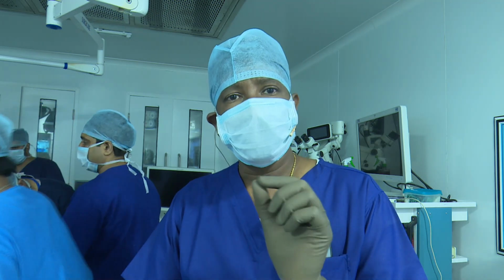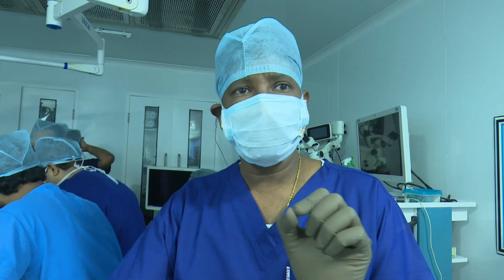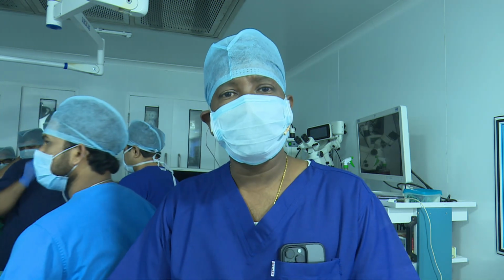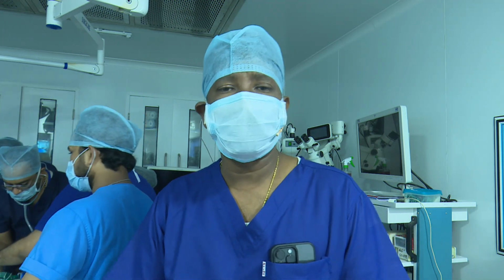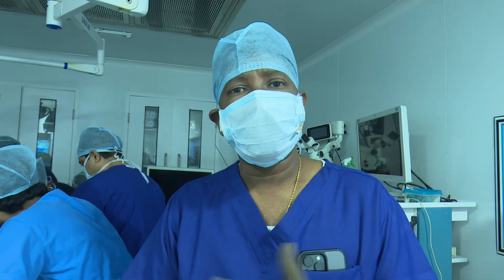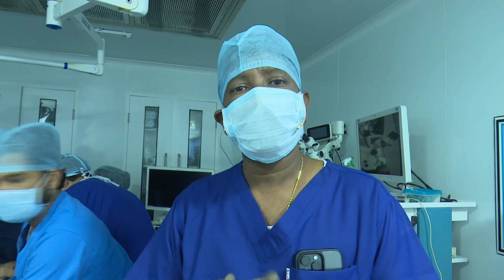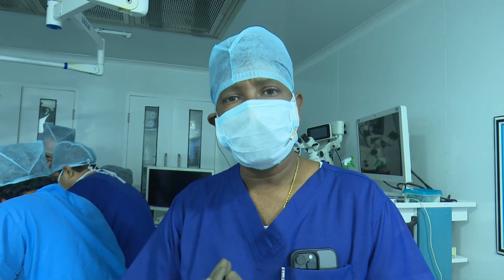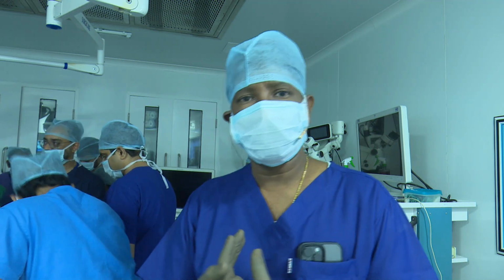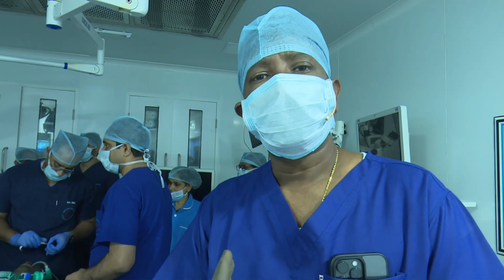So we keep the endoscope just at the tip of the uvula because we want to see what is happening below that. And sometimes in a few patients we have seen the entire hypopharynx, the aryepiglottic fold, arytenoid, everything collapses and blocks the airway. So that can also happen, and that should also be kept in mind while looking at the level of the tongue base.